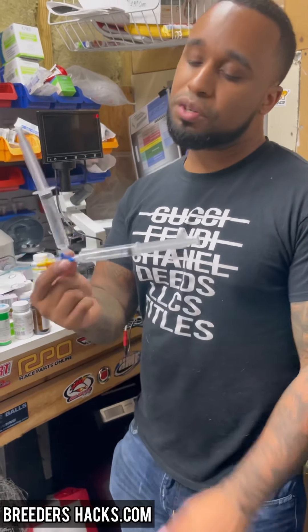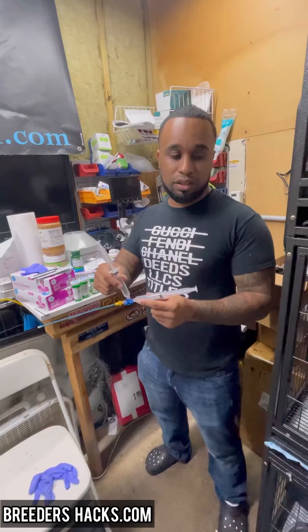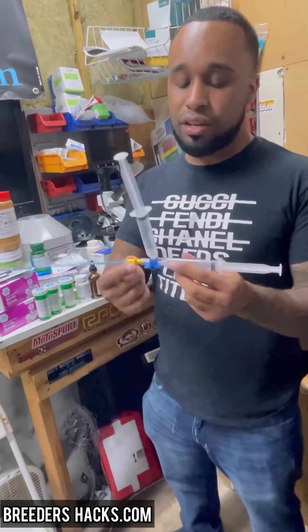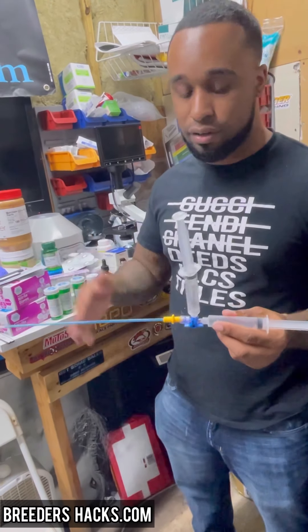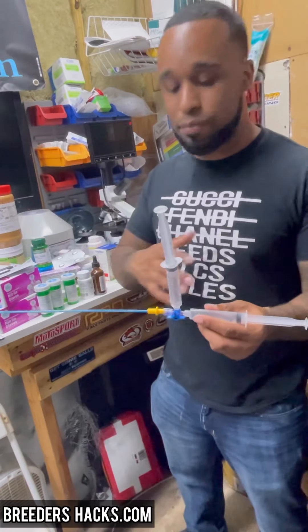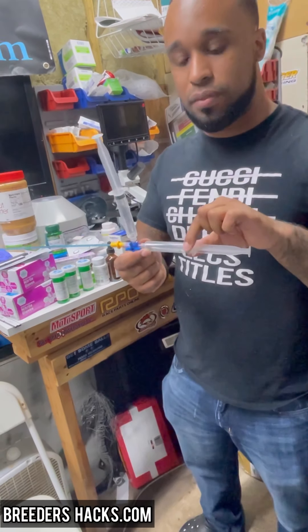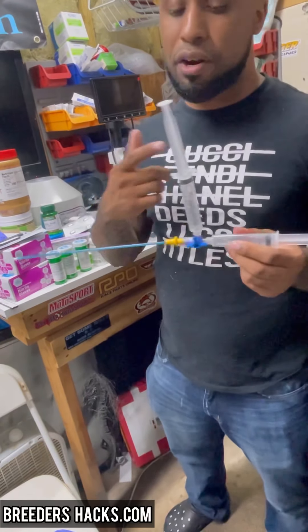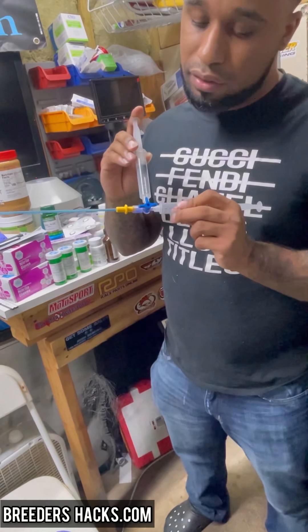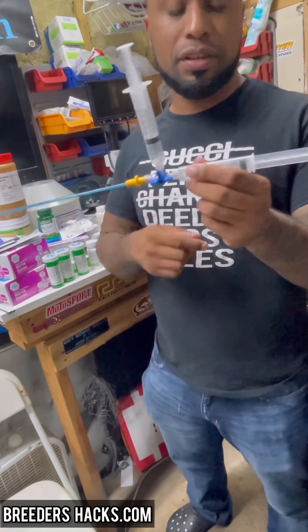Let me introduce you guys to the three-way AI kit. This is amazing because with the traditional way of doing AIs, it's just a pipette on a syringe — you take the syringe off and put it back on to flush the air and get everything out. Now you don't have that problem anymore. The bottom part is where you fill up the semen — the collection — and the top part is where you fill with air, so you can set your desired amount, anywhere between three and five CCs.